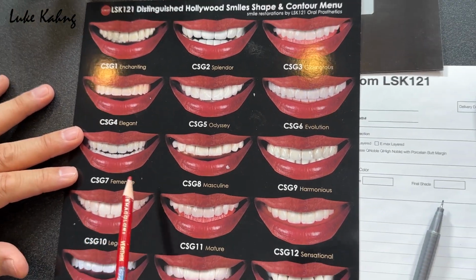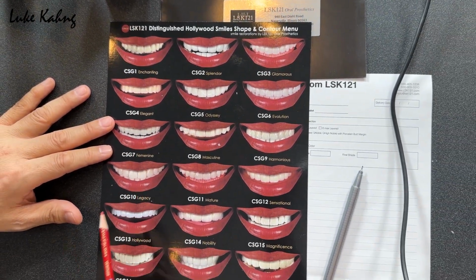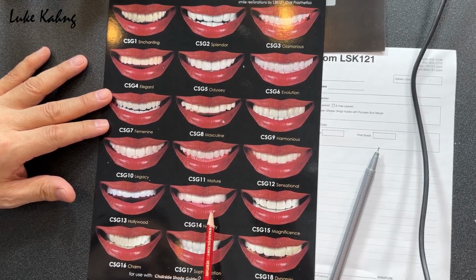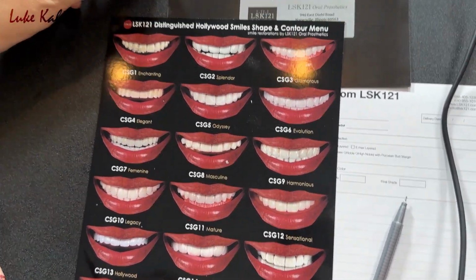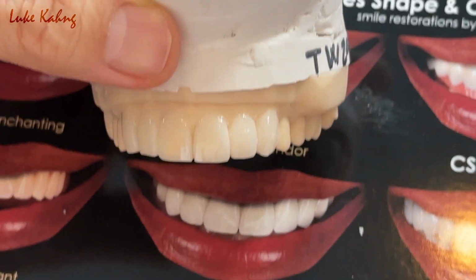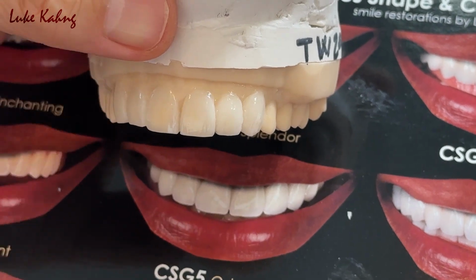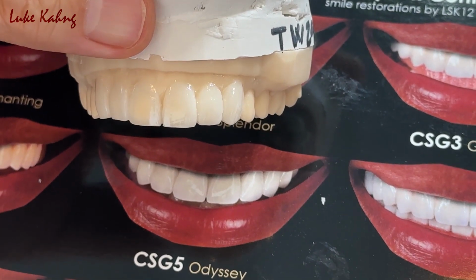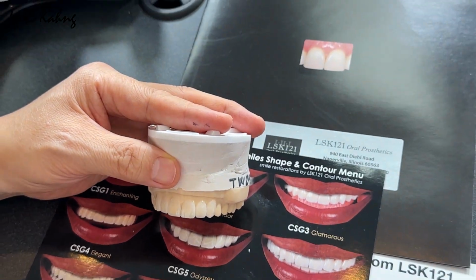All right, so we put it inside with the lips. The lips are kind of a Photoshop, but all the restoration is here, so we have a record here. So compared to what I finished, I can show them what I'm approaching for the final restoration. And also we're going to finish the prep, the margin, so you can see more detail about that.